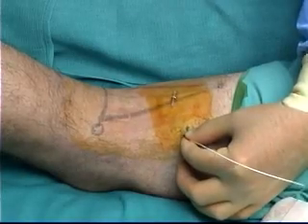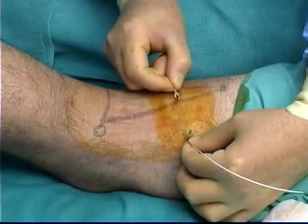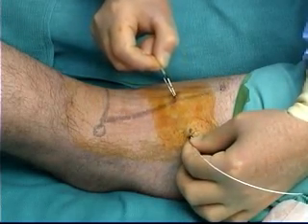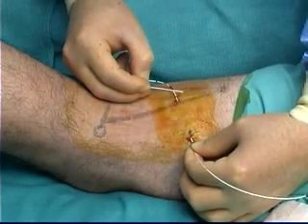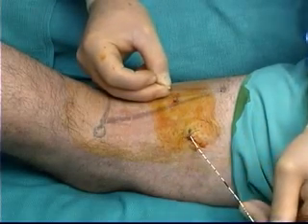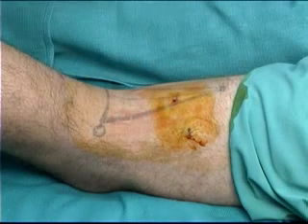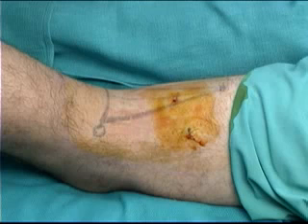Catheter removal is a sterile procedure and is done after the patient does not require the continuous nerve block any longer and after full sensation has returned to the foot. The proximal end of the catheter is fixated with the left hand while the distal end is removed from the skin bridge. This distal part of the catheter is kept sterile and the rest of the catheter is removed. If radiating pain is experienced during catheter removal, this may indicate that the catheter is coiled around the nerve and extreme caution should be exercised. This eventuality is a theoretical possibility that has not been reported yet.